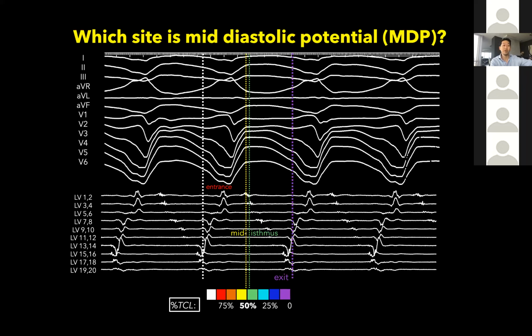because we know one of the limitations is that you can disrupt it, you can terminate it, you can accelerate it, you can transition it, and sometimes you're wasting 30 minutes of your time giving program stimulation in a tenuous VT patient. People forget that when you're doing program stim, sometimes you flatline a patient if you look at the A line. So clinically, even induction itself is a hemodynamic perturbation.